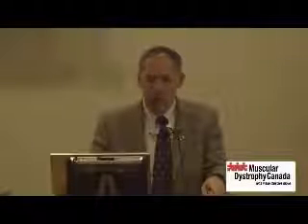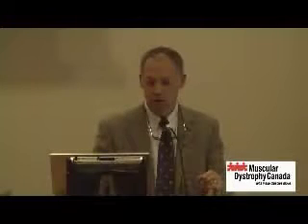When you teach this individual how to do lung volume recruitment, they move from this very small vital capacity, under 500 cc's, to this much larger maximum insufflation capacity. And you can see that there is both a range of motion that's occurring in the lungs and the thorax, as well as the achievement of a much higher peak expiratory flow, which will be correlated with the ability to cough. So these peak flows are much, much higher.